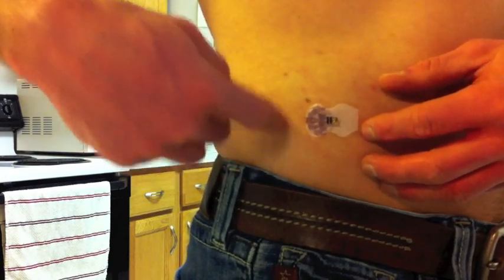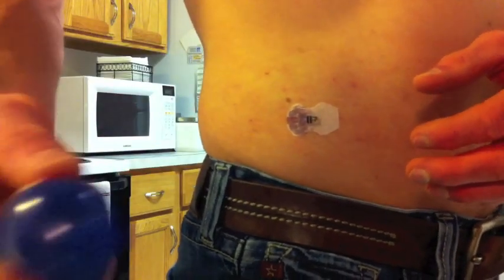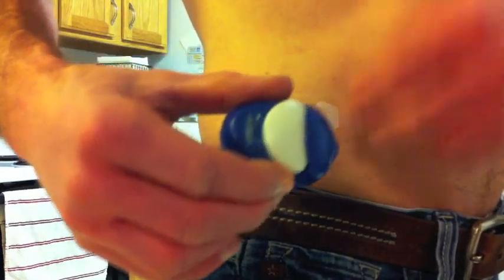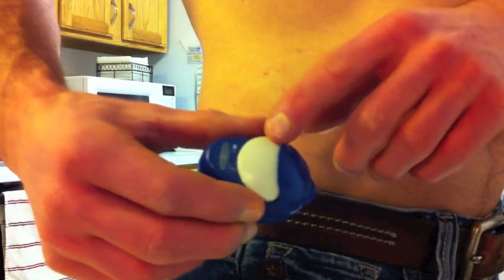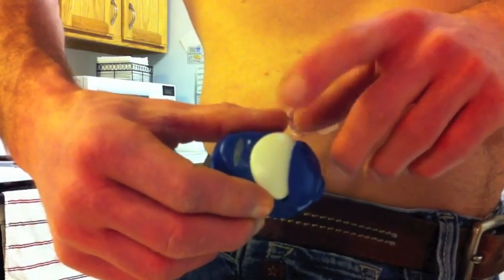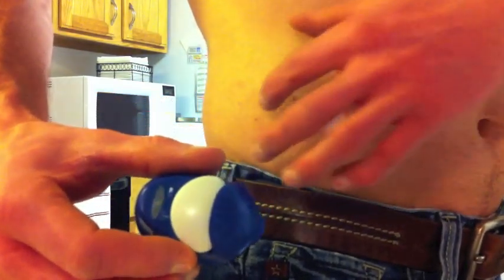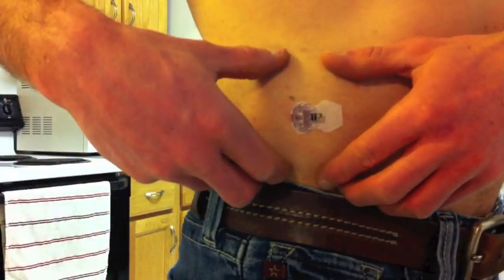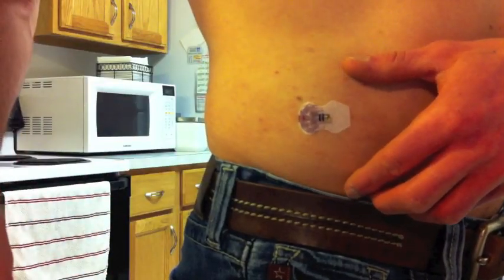Now you need to let it sit for 15 minutes, and then you'll come back and attach the sensor. When you attach it, there should be about five green lights blink, and that means the sensor is working and has good battery life. Then you wait two hours to calibrate with your insulin pump.